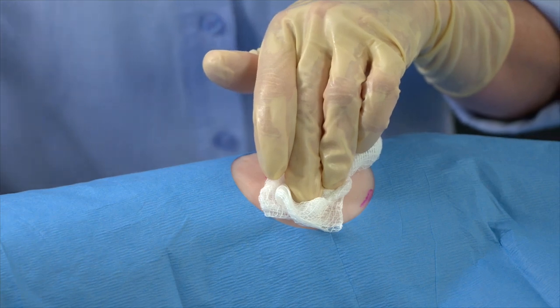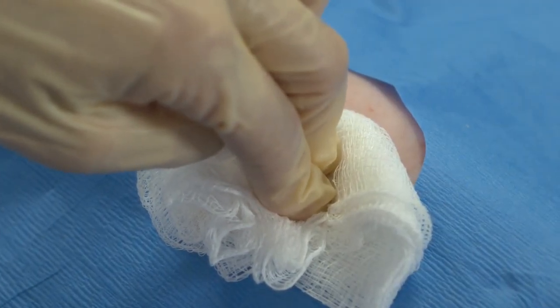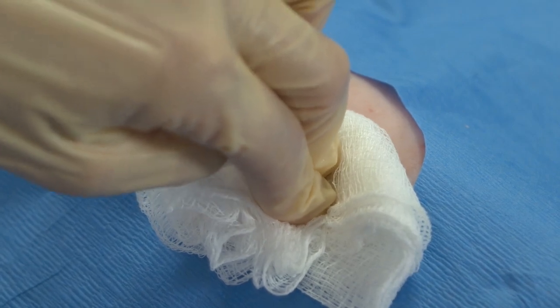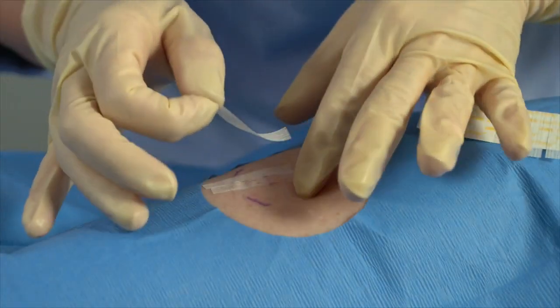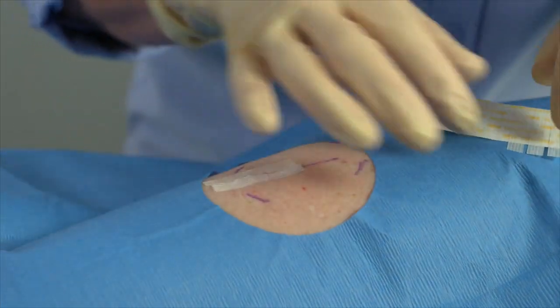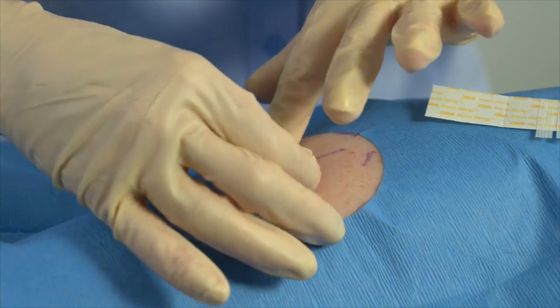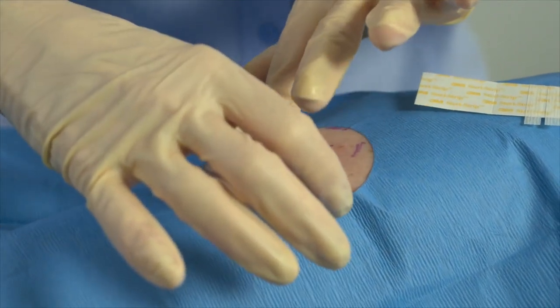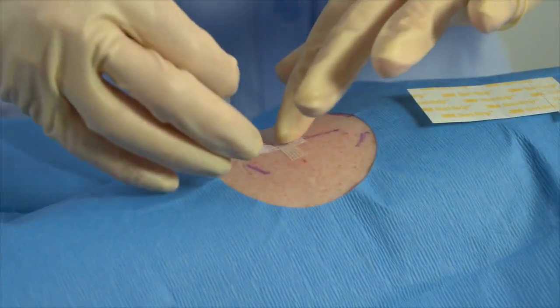Apply gentle pressure to the incision line with sterile gauze for several minutes to stop any bleeding. Once the incision area is dry, gently align the edges of the incision together and place 3 steri-strips across the incision line. The steri-strips should lie flat and not gap to ensure the best healing of the incision. If desired, place 2 additional steri-strips perpendicular to those just placed.